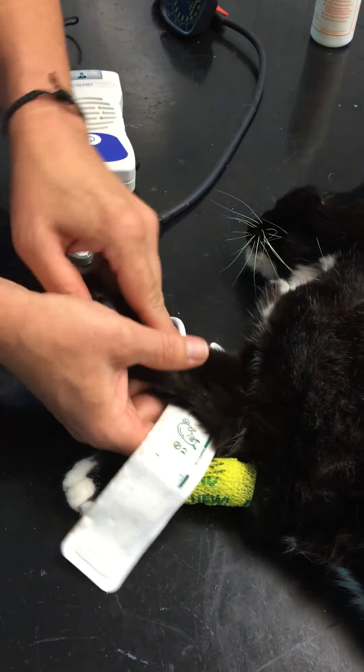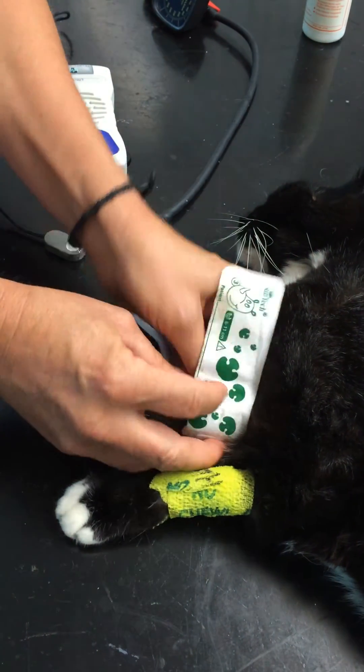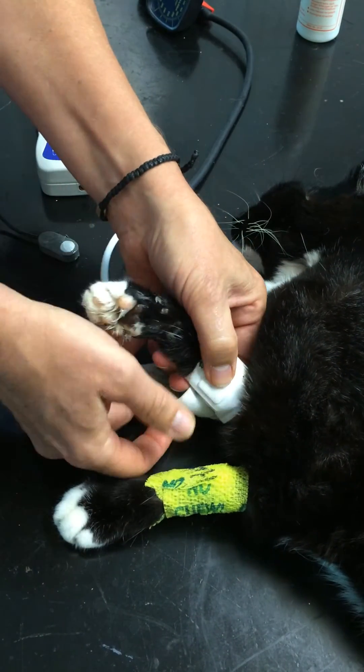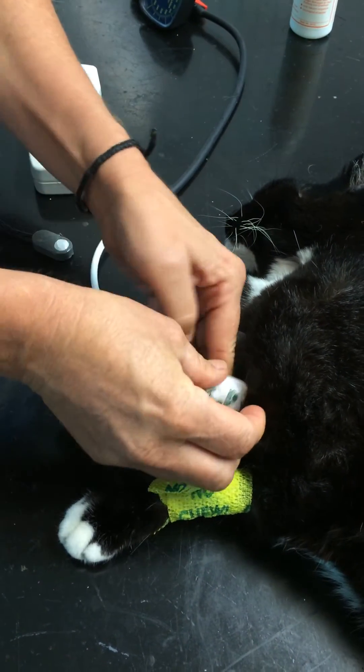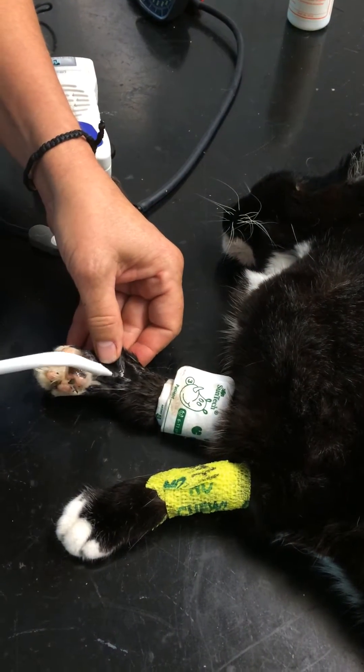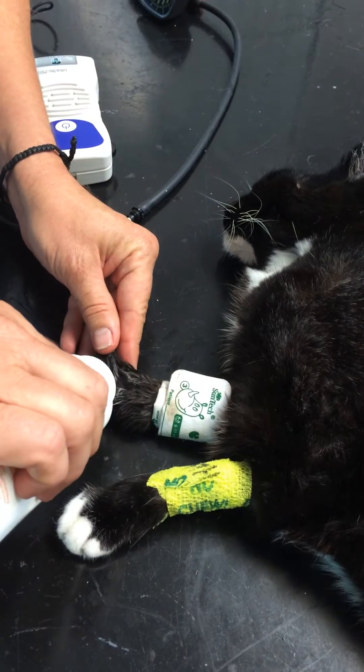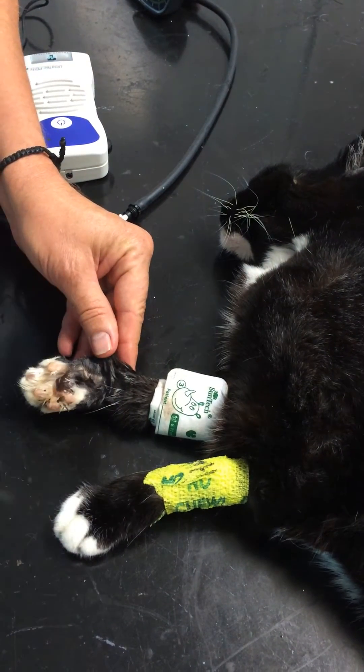Cat blood pressure on a cat with medetomidine. Cuff on tightly, just below the elbow. I'm going to prepare the area here with alcohol to get the oil out of the hair, and then apply lots and lots of Doppler gel.